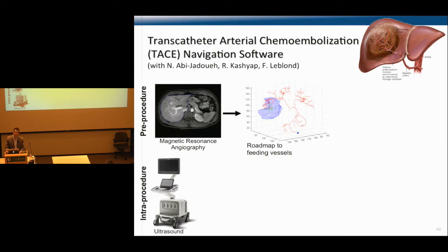I had one more question, if I may. Your segmentation method, is it fair to say that it is a modification of the level set algorithm, or is it completely different? It's different. It's more inspired by deformable models, more the point distribution models. If you're talking about the MR segmentation, we're building a training set, using statistical knowledge, and deforming a mesh by searching for optimal boundaries. It's more inspired by PDMs.